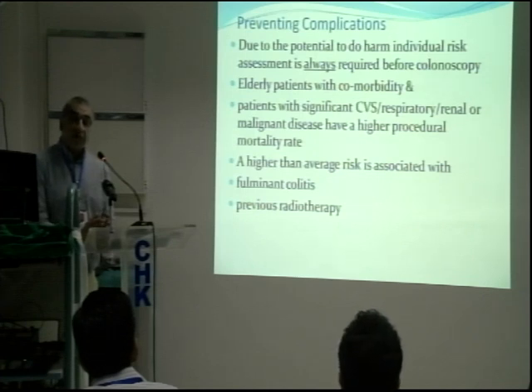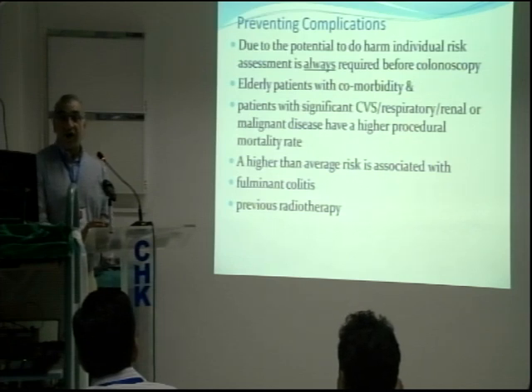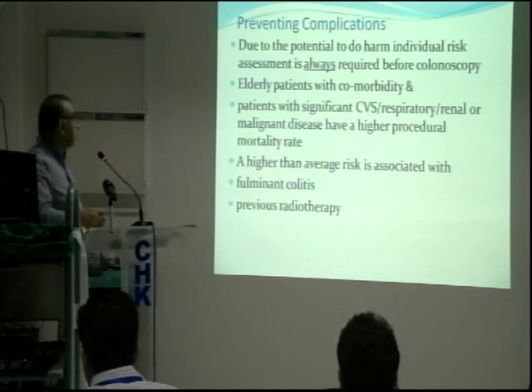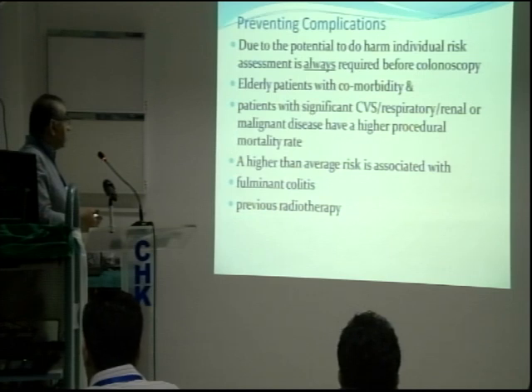In that case, please do a colonoscopy or a CT colonography. If it's not going to change your management, if the patient is bed-bound, wheelchair-bound, not even fit for a haircut, there's no point in doing a colonoscopy in him. So always select your patient using common sense, right? Do not do it in patients where you may cause more harm.